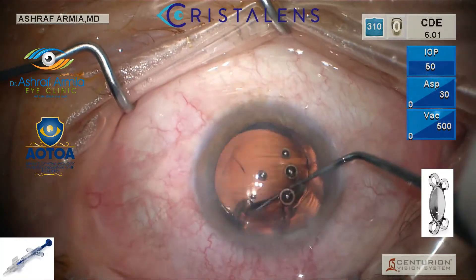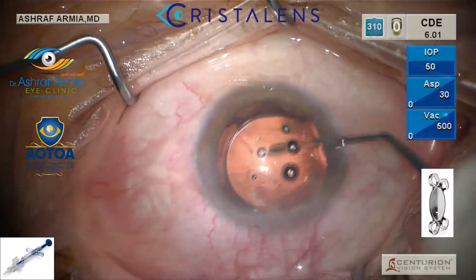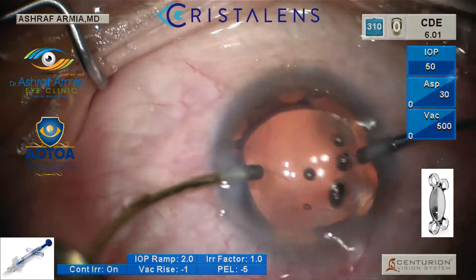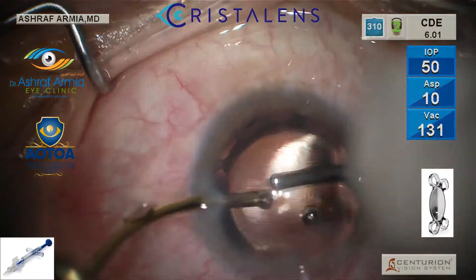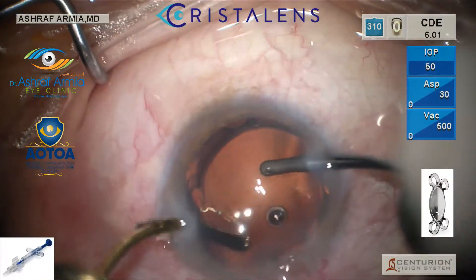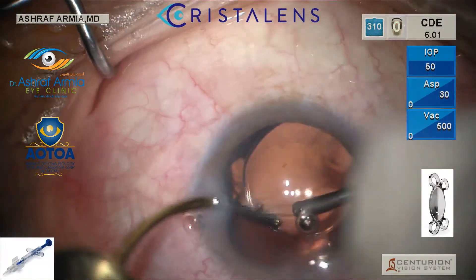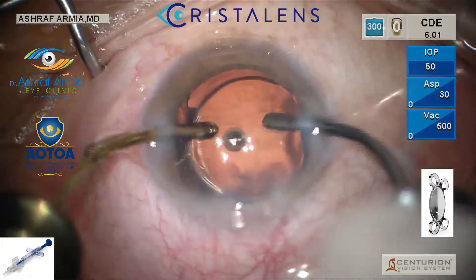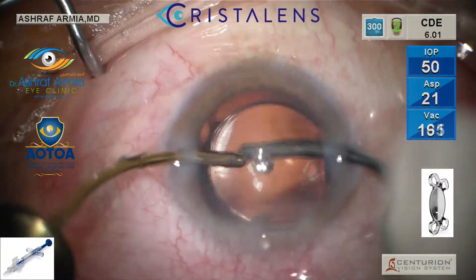Then it's very easy to rotate to put the four haptics inside the bag. It is mandatory in these hydrophobic lenses to remove all the viscoelastic inside the eye and behind the IOL.